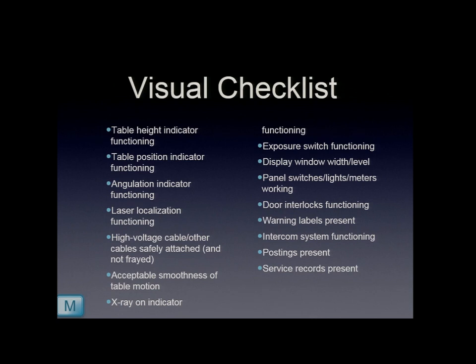And then, of course, as I said, the ACR has the visual checklist. And this is really things that normally you would just take for granted, that you're operating the system, using all of these mechanisms on your scanner, and you may take it for granted. And you really are making these mental notes that, oh, there's a problem here, I'll fix it later. Well, it doesn't get fixed later. So this is a way to just say at least once a month, somebody's going to document it. That way they can say, okay, I see you documented that there was a problem here, so what's your corrective action, that type of thing.